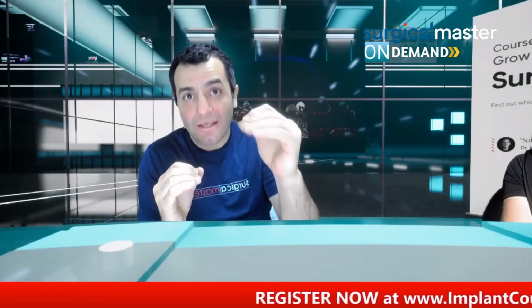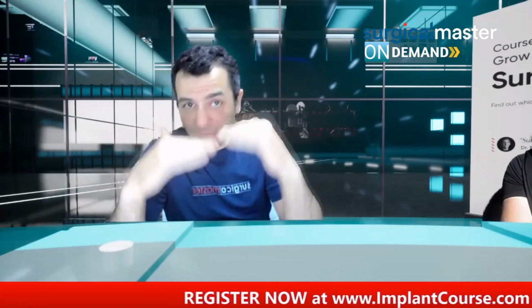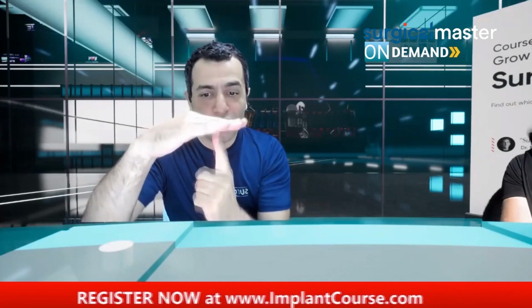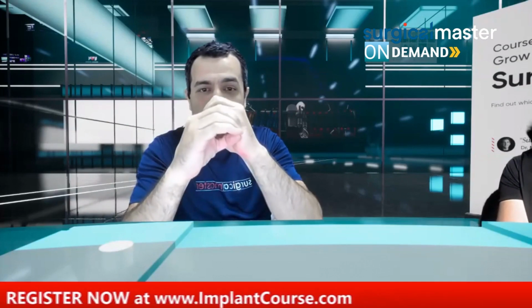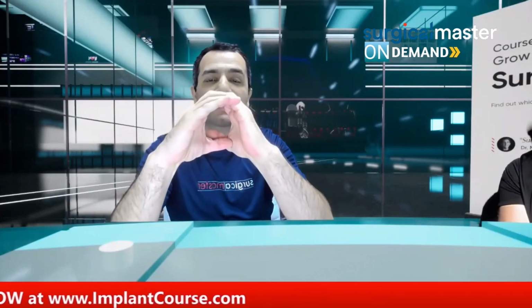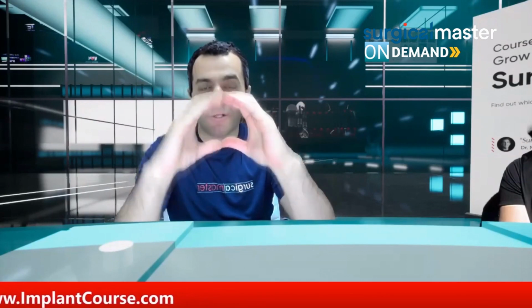So right to the floor of the sinus, and that's the most difficult part. Get there, start learning how to identify that cortical plate at the floor of the sinus. Take multiple PAs to make sure that 2.0 millimeter drill is right there at that floor. So you got this drill, the 2 millimeter, to the depth. Now go to this one, the slightly larger one, then to this one, then to the 4 millimeter.